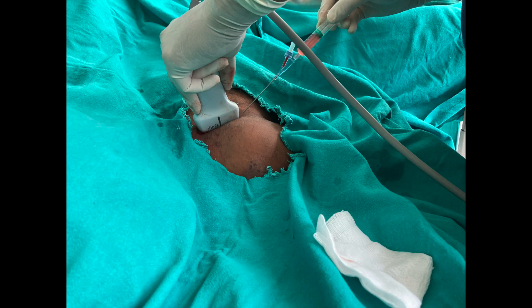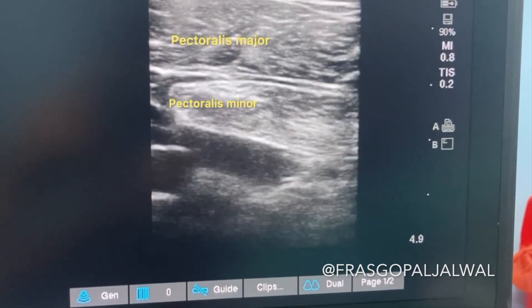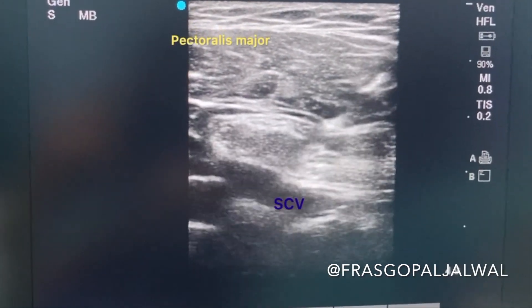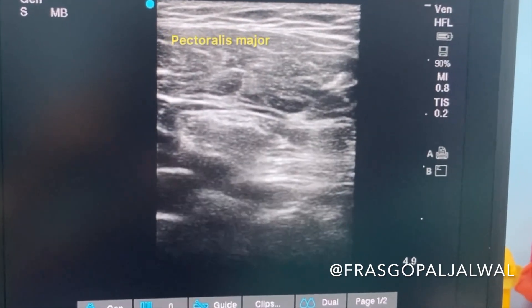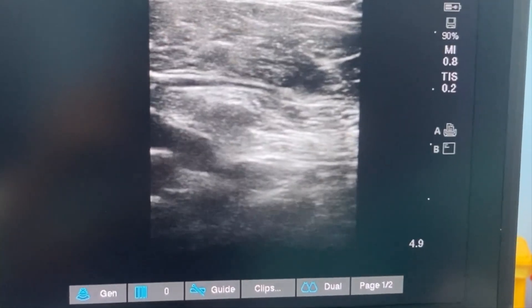To perform the subclavian vein CVP line insertion, take all aseptic precautions and localize the subclavian vein in long axis view as described. Then introduce the puncture needle using the inline technique. Here you can see the pectoralis major, pectoralis minor, and the subclavian vein below the pectoralis minor, with the needle approaching toward the subclavian vein. When you puncture the subclavian vein, you will feel a pop, and after feeling the pop, aspirate blood and insert the CVP line. Thank you.